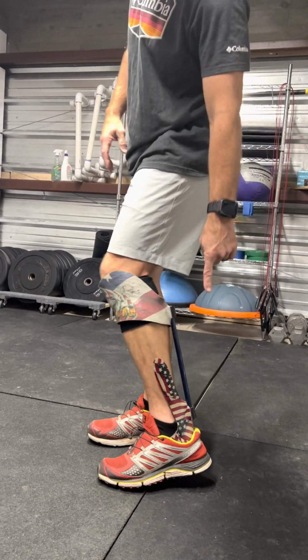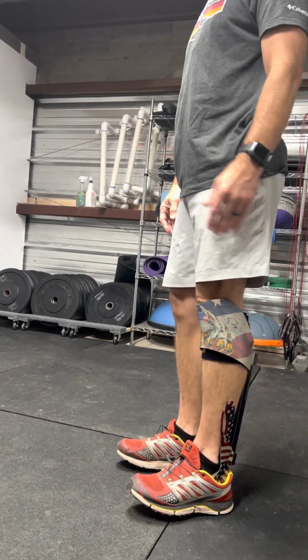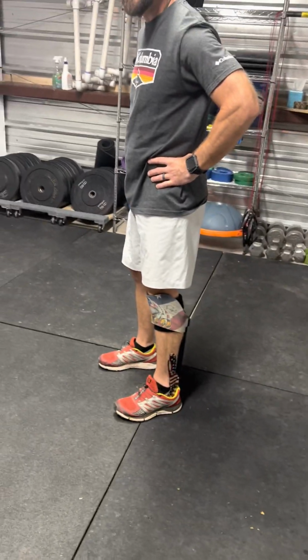If I'm standing flat-footed, you see it, like I talked about earlier. Some people don't get a heel wedge like I do. I have a heel wedge underneath there. It will slap you back, kind of like I was talking about when you're going uphill. But you can stand on your foot like this, but it doesn't unload you as well.